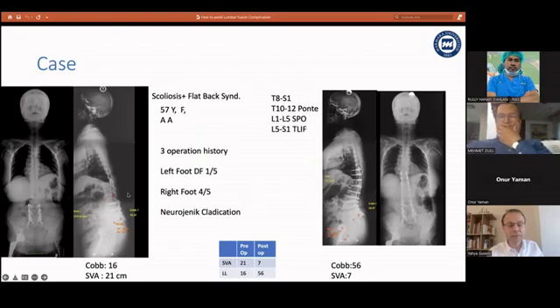Again, a patient who has a history of 3 operations at these levels, and again, there is not enough lordosis in the rods, and there is no interbody graft in here. So there is no good lumbar lordosis achieved. 3 years later, she has again severe back pain and walking disturbance. We made revision surgery, we made lordosis again, and we went to upper levels to prevent complications.